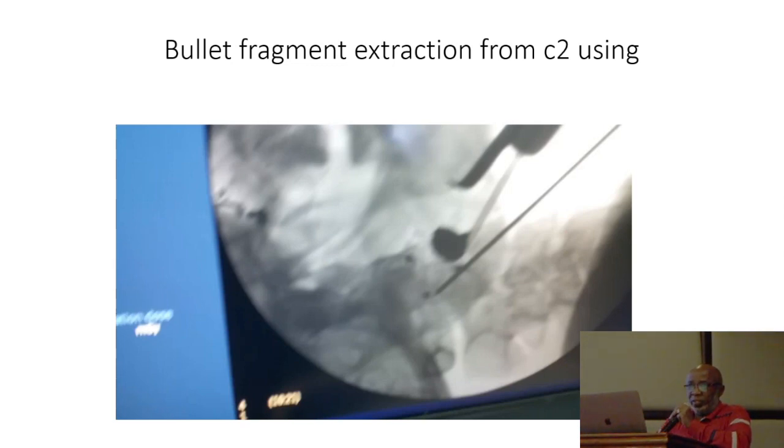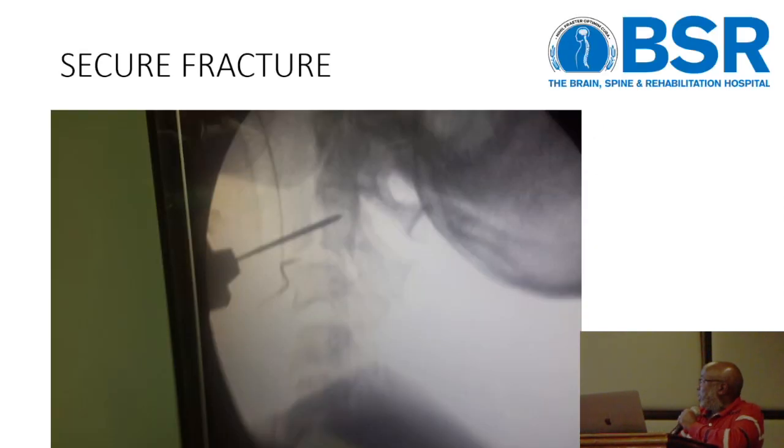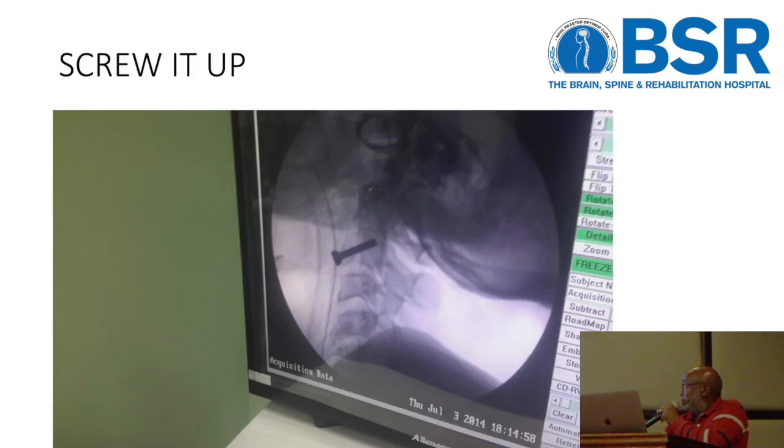The video for this one is very exciting because we actually pulled it out transorally. I was hoping I would have shown it. And then we put an odontoid screw to stabilize that fracture and left the patient.